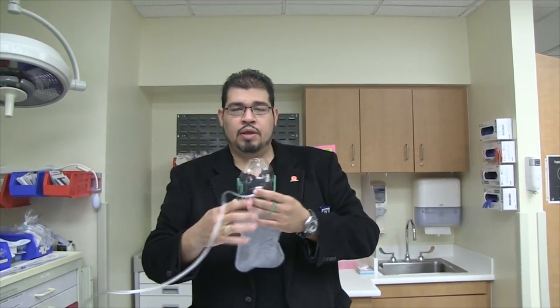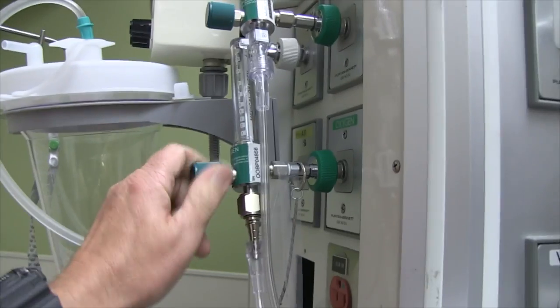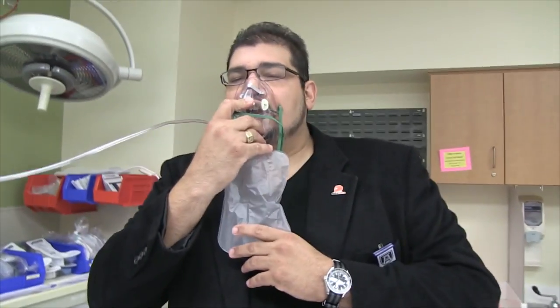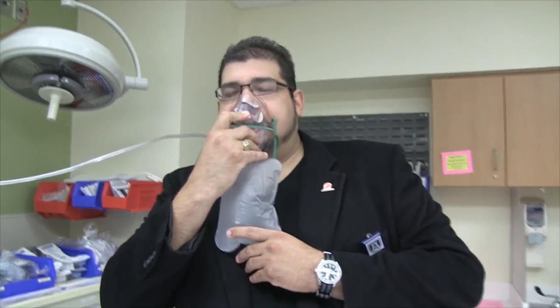Okay, let's do this. I'm going to crank this way up. See if you can overwhelm the mask this time. Okay. Here goes. You're not emptying that bag.